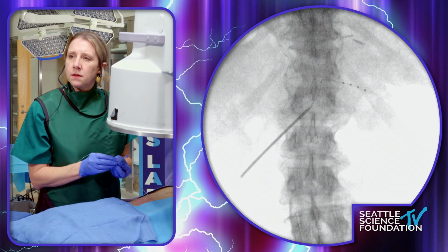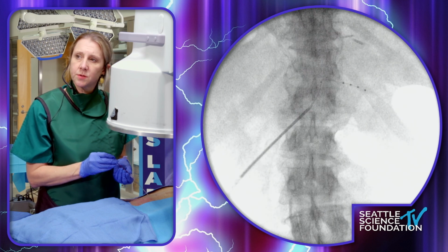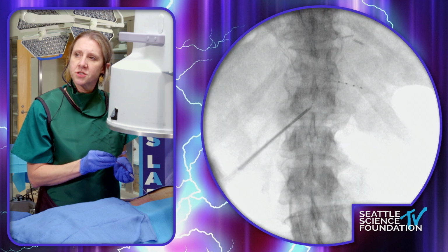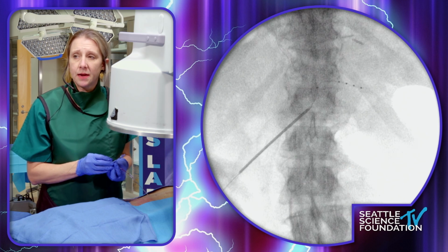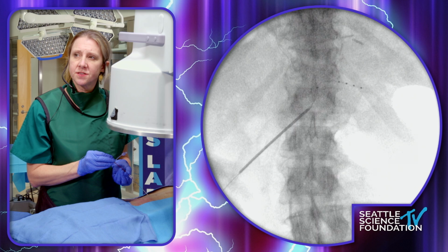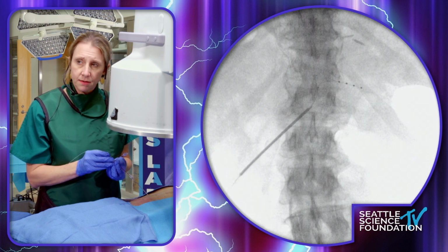Okay. And I think what I'm going to do is withdraw everything. Picture. So I withdrew, as you can see, both my catheter and also my lead, so that the first contact is right underneath the pedicle.